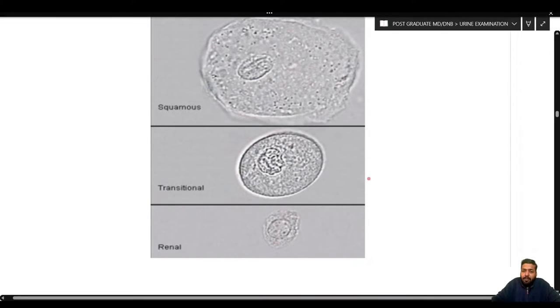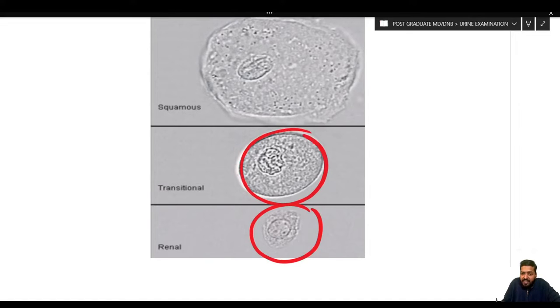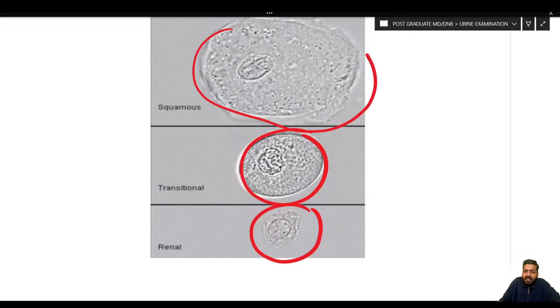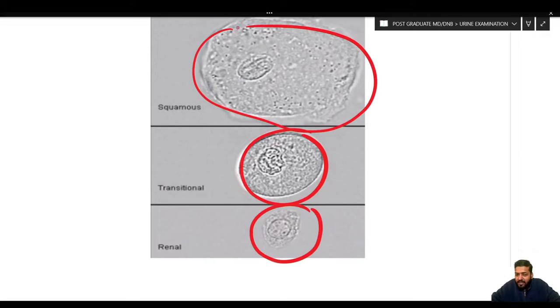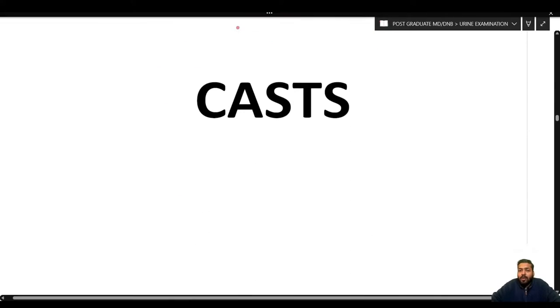To compare the different types of cells according to their size: renal tubular epithelial cells are the smallest, transitional cells are a little bit bigger, and squamous cells are the largest in size. With this, we have finished the discussion on cells and will now discuss casts in detail.